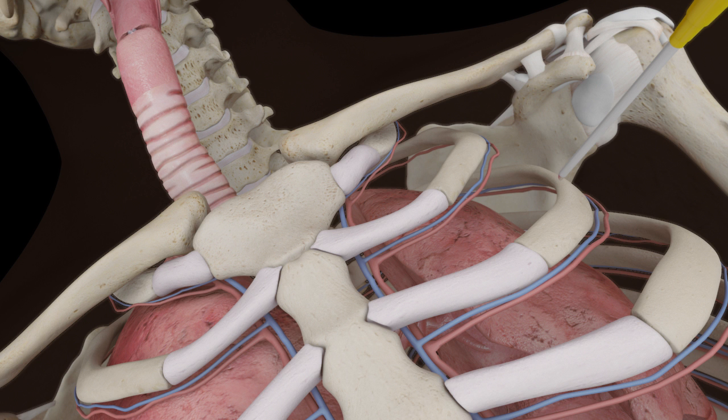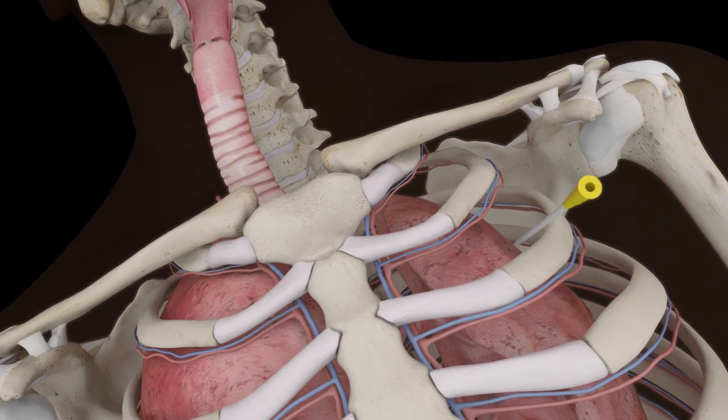A needle decompression catheter is inserted perpendicularly to the chest wall, at a 90-degree angle, just above the third rib in the mid-portion of the clavicle. The insertion site should be as close to the upper portion of the third rib as possible to avoid blood vessels that are located just under the lower portion of each rib. The catheter is slowly advanced approximately 1 to 2 inches into the chest, and a gush of air is generally heard. The inner needle is then removed, leaving the catheter in the chest to equalize the internal and external pressures.